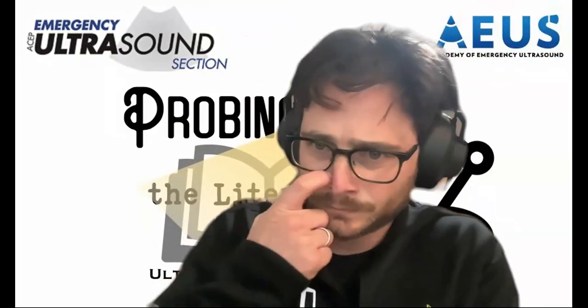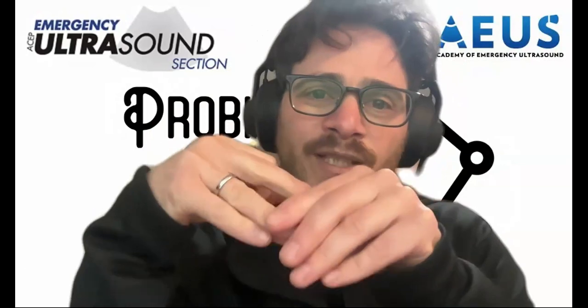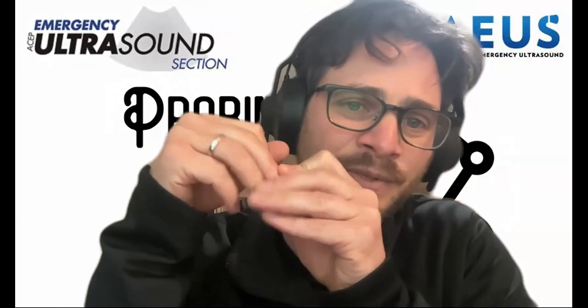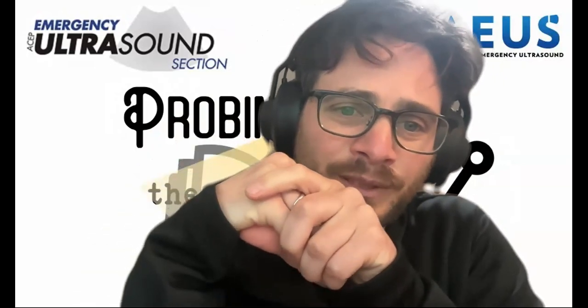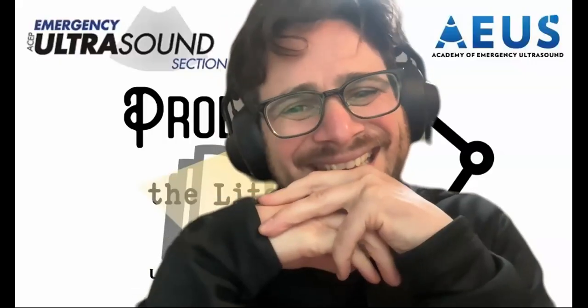together? Yeah, do you mean the fluid resuscitation and sepsis stuff? Totally. For sepsis, there are really three things: who needs fluids, who needs pressors, and where's the source? That's another aspect of ultrasound that becomes really helpful. Those are our three questions, and then we figure out if they need to go to the ICU because we've started an epi or not, or if we'll probably have to intubate them. Yeah, that's right. That's the $1 million question, or the $1 million questions.